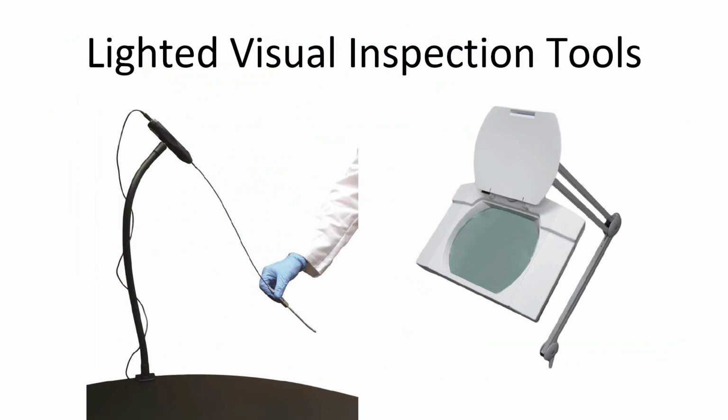Next slide shows photos of different visual inspection tools that are available that your facility can use to really take a look at the endoscope. On the right, we have the lighted magnification that can look at the distal tip, look for any damage, look for organic debris, and really give you an enhanced visual verification that you wouldn't have had before. And on the left is a photo of a flexible inspection scope. So this is actually a borescope that can look through the openings on the endoscope, and you can see debris inside the channels.